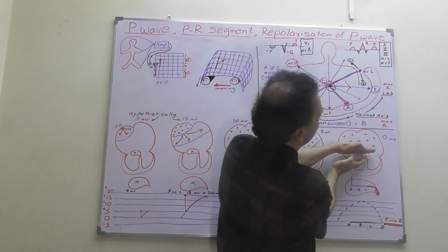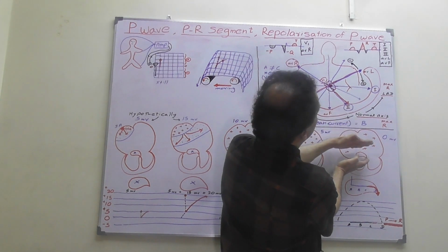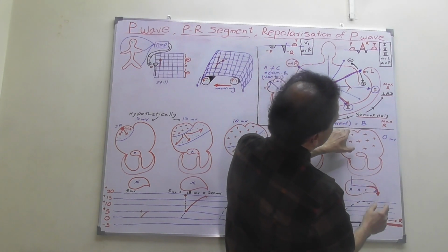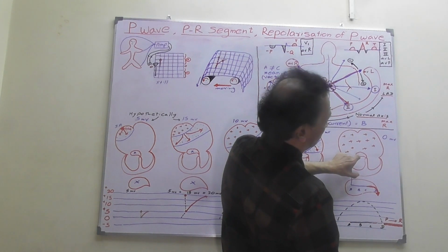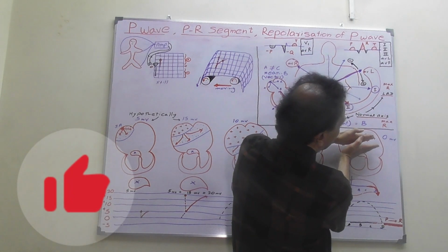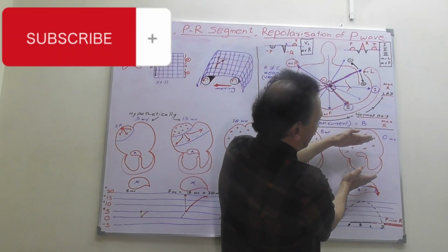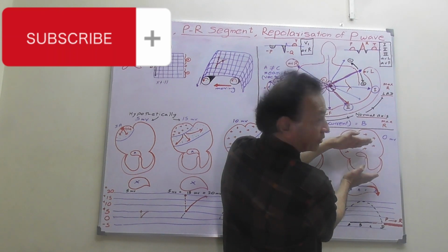Contraction has already occurred, now the repolarization of the atria also. As the current is lesser here and the current is a bigger amount here, this small amount of current is hidden inside the QRS complex produced due to the contraction of the ventricle.